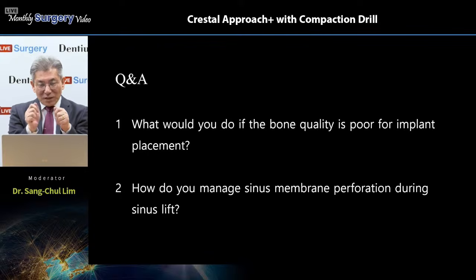Ideally, we can separate the sinus membrane from the sinus floor, detach the sinus membrane from the floor a little bit more and more apart from the perforated area. Theoretically, and in our brain, it is working well.